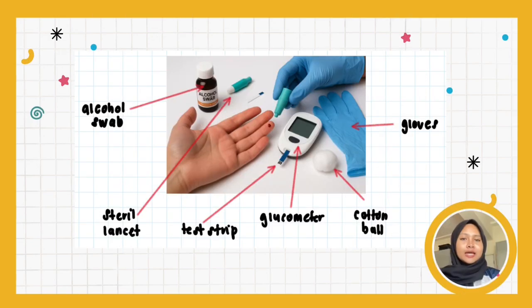So, these are labeled pictures of the setup of the experiment that we do for the blood glucose test.